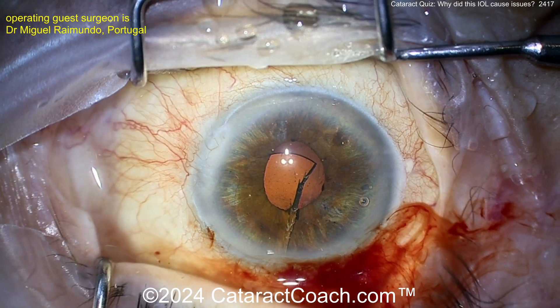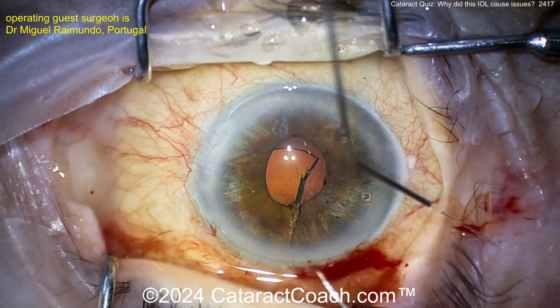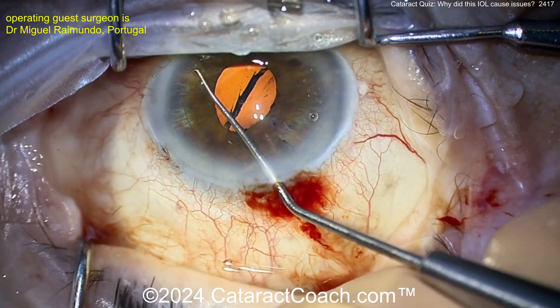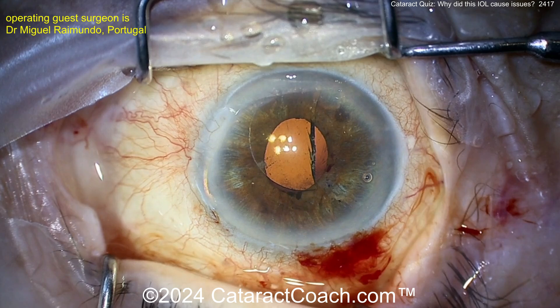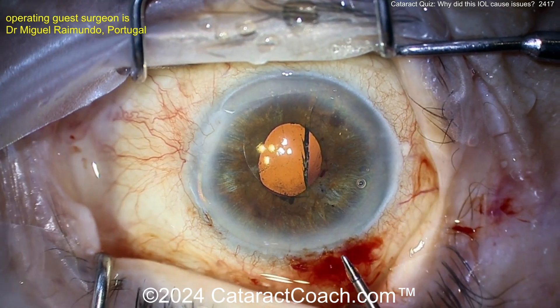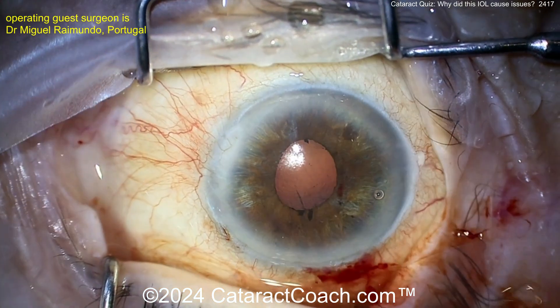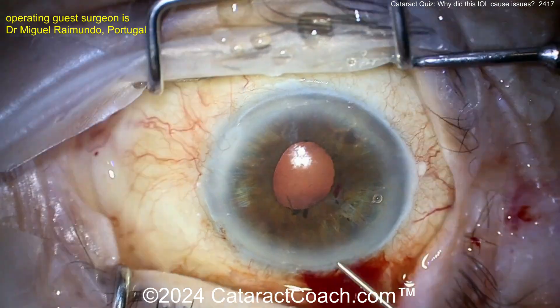So what would you do instead? You're going to put a three-piece lens in. In this case I'd choose a silicone lens with a nice smooth surface and not too sharp of an edge — in a three-piece version. Get that in the capsular bag hopefully. That's the first acrylic lens now removed.